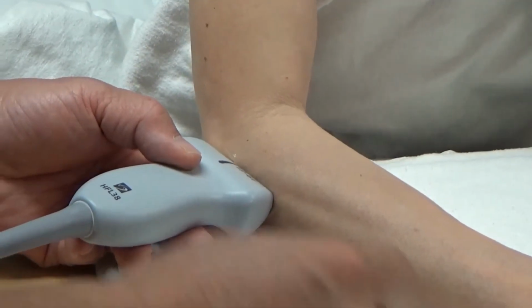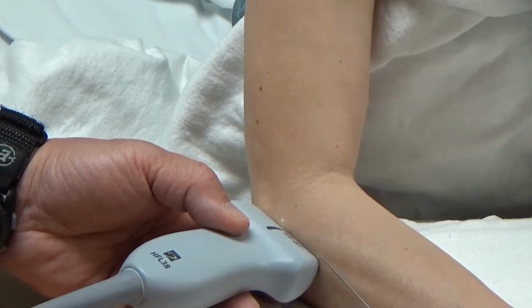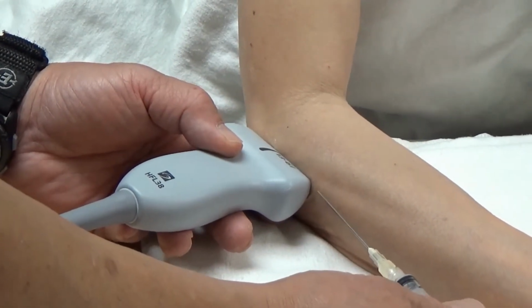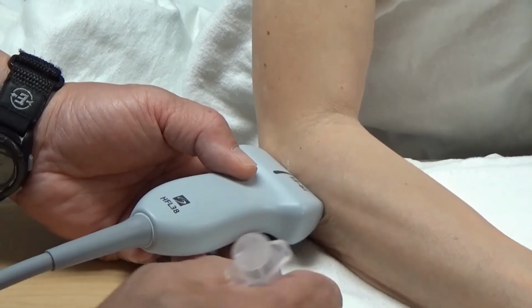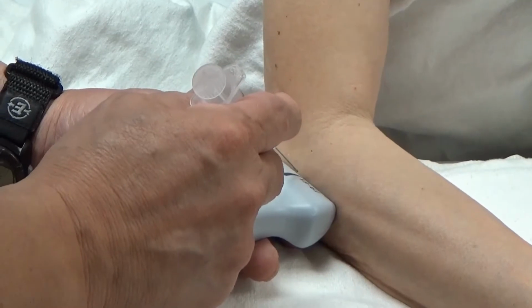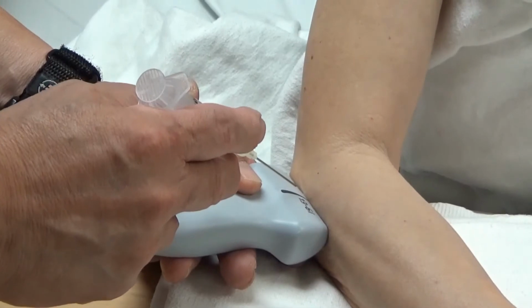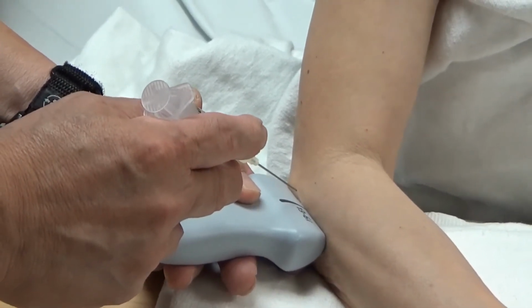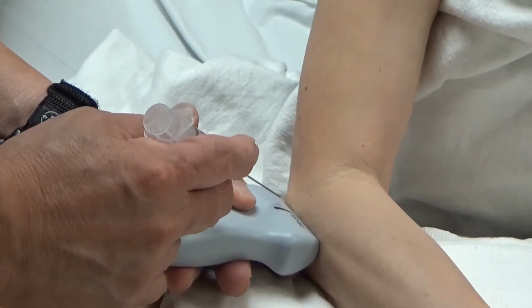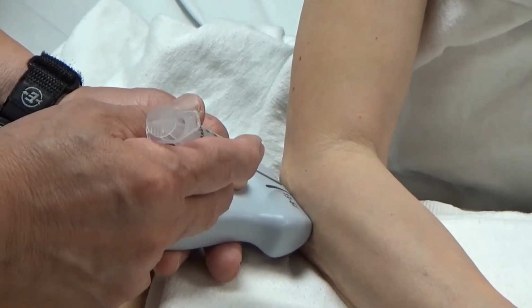However, because Linda has very little subcutaneous tissue, and because of the size of the transducer, it's very difficult to do this procedure in the in-plane technique. So what I have found more helpful is to approach the tendon in an out-of-plane technique. Of course, you can use both techniques and then decide which one is best for you. So for very thin patients, as we have with Linda, I find this is much easier to perform.